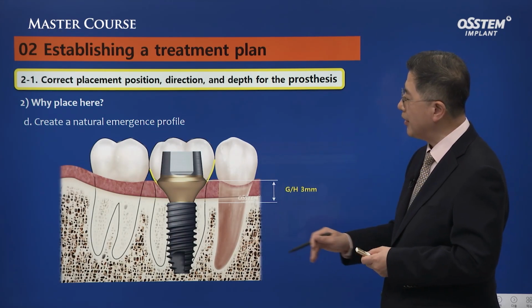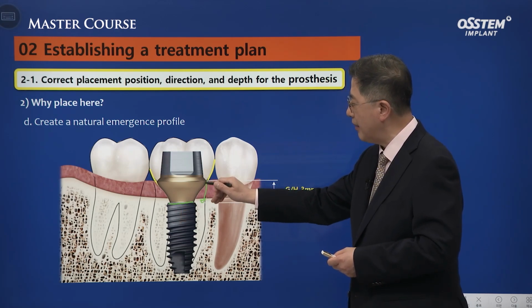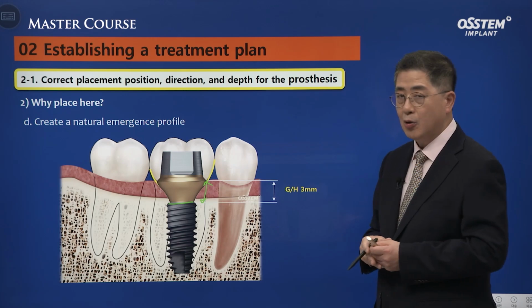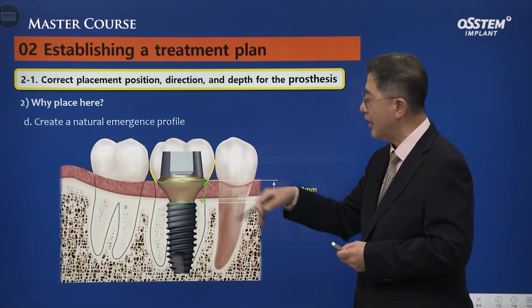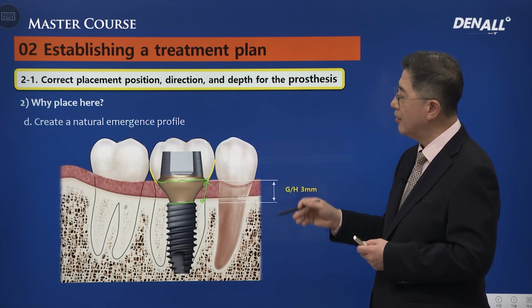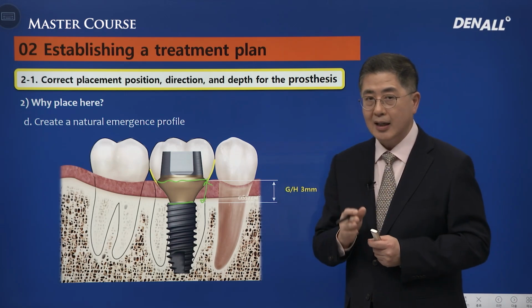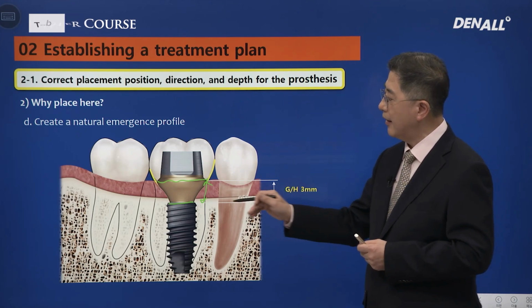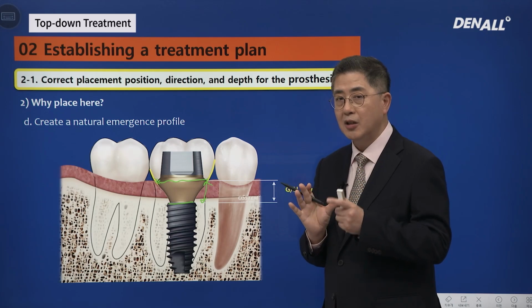Generally, if an implant is appropriately placed and maintains a biologic width of 3 millimeters, as previously mentioned, using an abutment diameter of about 7 millimeters usually does not pose significant problems. Personally, I use CAD/CAM abutments, and the length that I measure for these usually comes to about 7 millimeters in most cases.